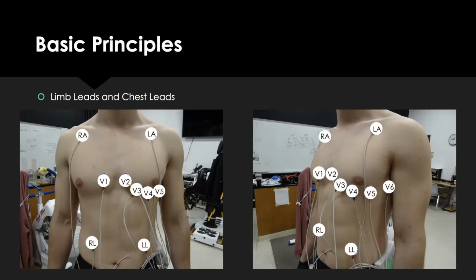Right here you can see the placement of the limb leads: the right arm lead, the left arm lead, the right leg lead, and the left leg lead. And then over here you can see the chest leads. The chest leads are V1 and V2 on either side of the sternum, between the 4th and 5th rib.